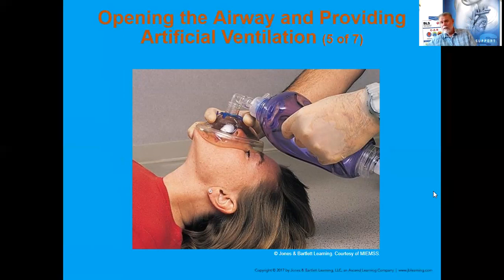This is demonstrating the EC technique for the patient. The EC technique allows you to really cuff the bag valve mask. That's my C, and my E are these three fingers that I can hold along the jawline. I mean, we can look at this slide for days, but until you get an opportunity to put that bag valve mask on someone's face, or even the mannequins that we utilize, it's just something that requires practice.